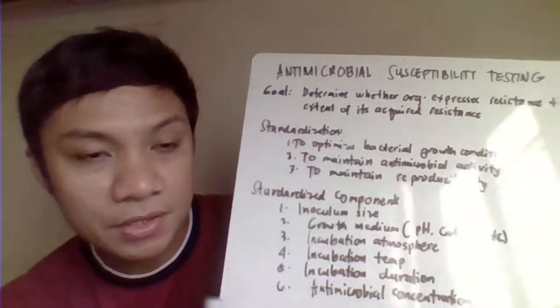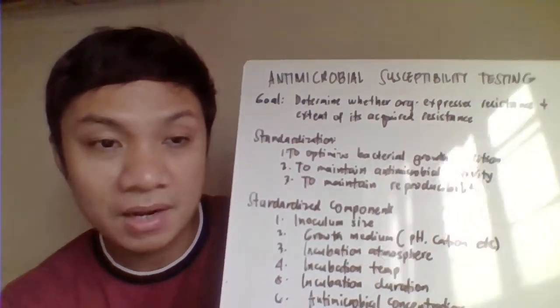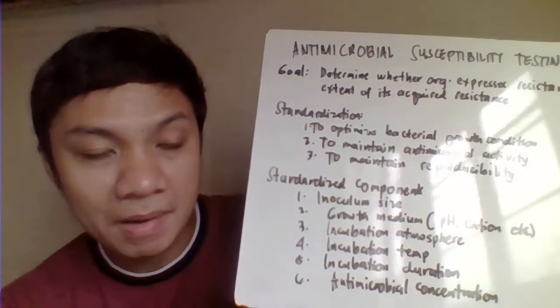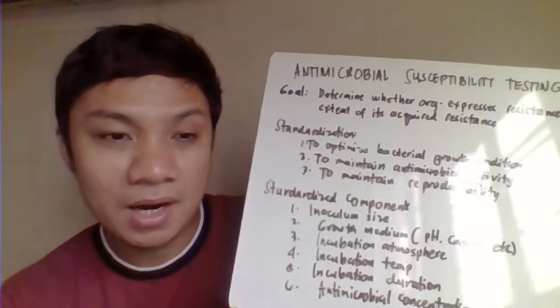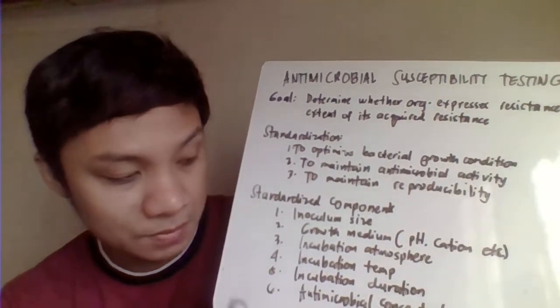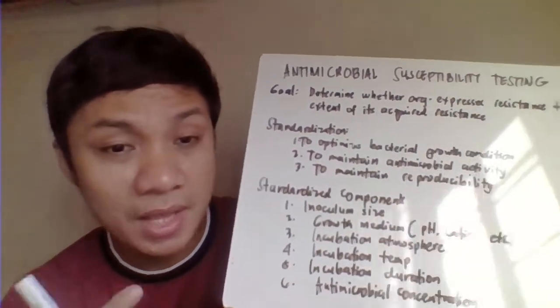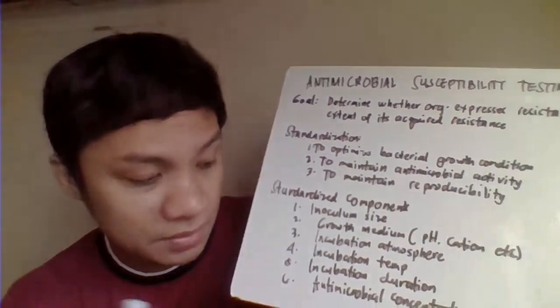Third one, we have also incubation atmosphere. So ano bang gas requirement niya. Then incubation temperature, pag bacteria, we are using 35 degrees Celsius. Incubation duration, up to 24 hours ba? 16 to 18 hours, 16 to 20 hours.